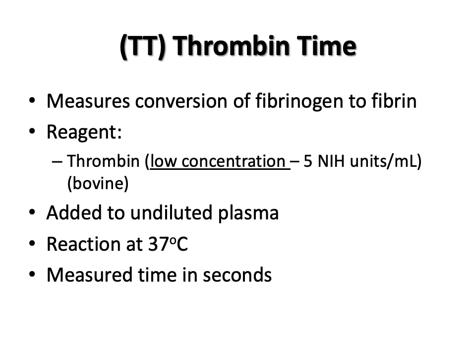The thrombin time involves only the addition of thrombin to citrated platelet-poor plasma. Therefore, it is a measure of the conversion of fibrinogen to fibrin. It is also sensitive to the presence of inhibitors that may be present in the plasma, like heparin.